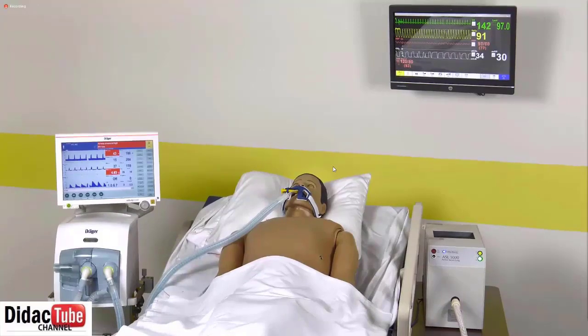Then when we actually intubate our patient, as you see in this picture here, we have him on a real ventilator, and that ventilator is delivering support through the patient circuit, through the mannequin, through that other patient circuit, leaving the mannequin, and to the ASL5000. It's very important to note that the airflow is bidirectional between our patient, the ASL5000, and the ventilator.